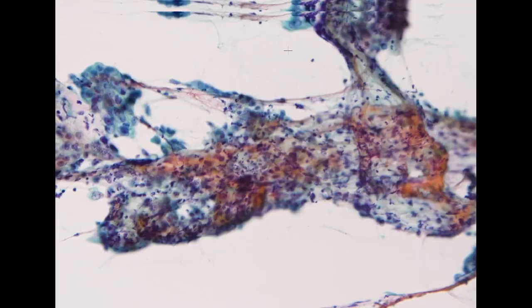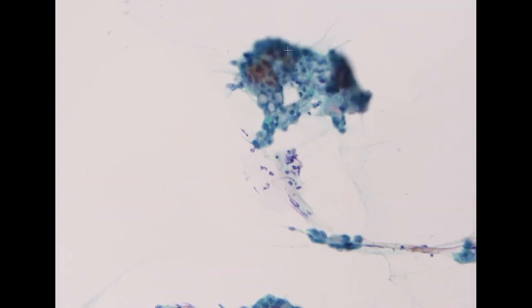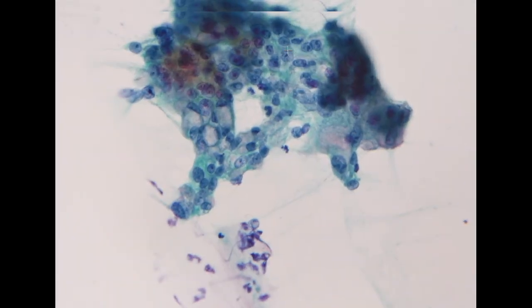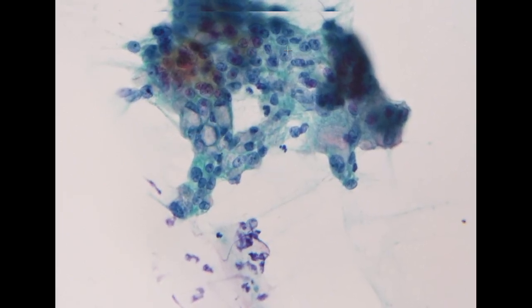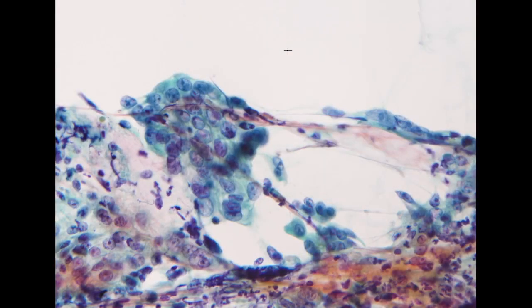So they do two different smears from the tumor. So this one is also easy for the diagnosis. We have unequivocal nuclear atypia. We have abundant mucin production in the cytoplasm. So this is also positive for adenocarcinoma.